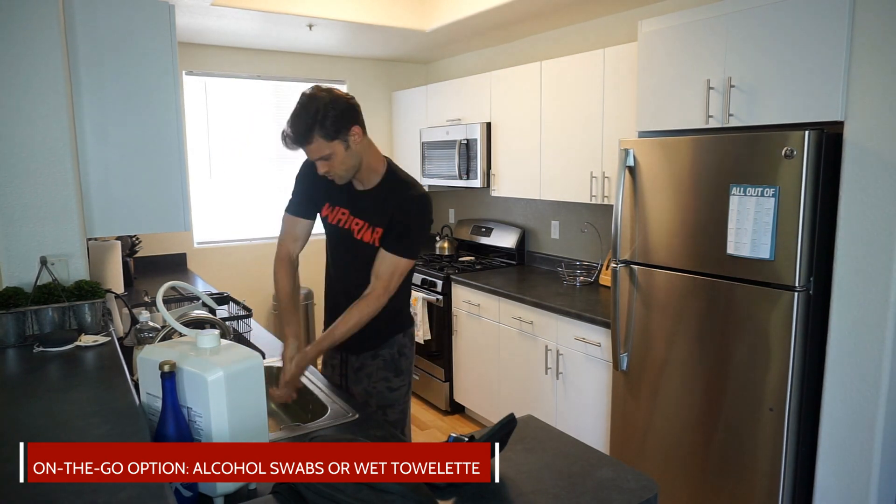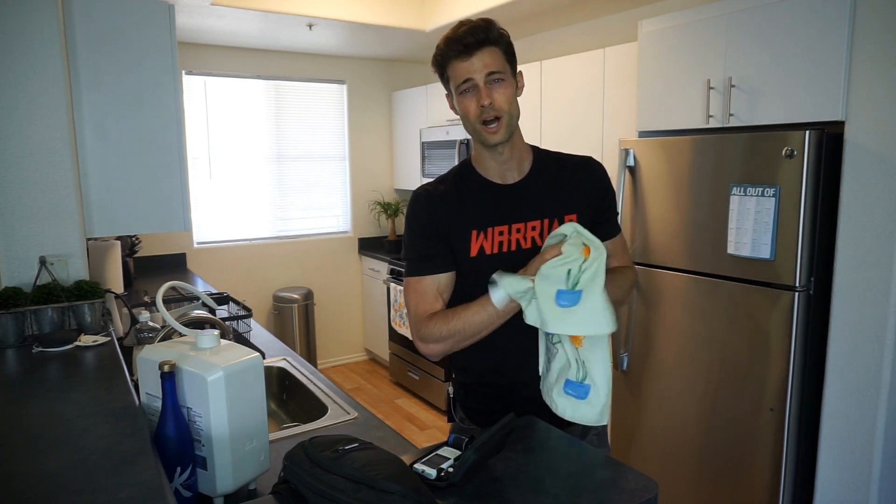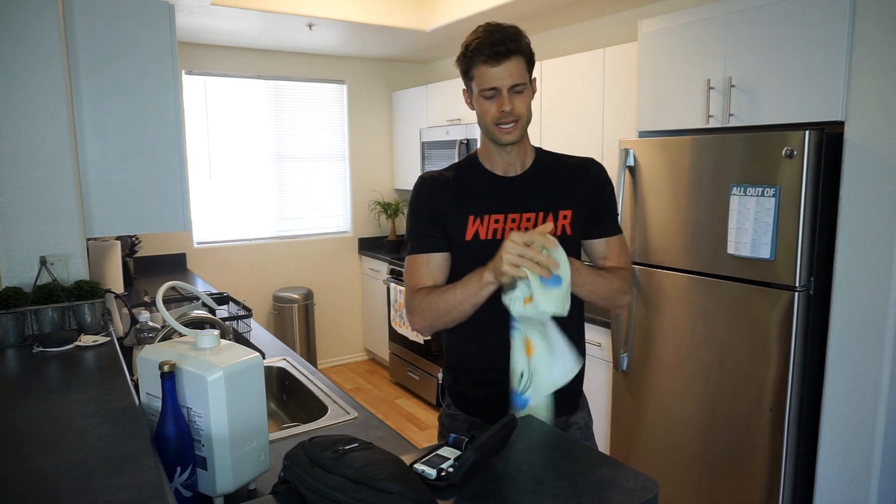First things first — we're going to wash our hands. Make sure your fingers are clean. Reason being, if you have sugar or anything else that can alter the blood sugar measurement, you might get a false high. Your blood sugar might be at 93, but the meter shows 250. If it's 250 and you take medication to bring that down but you're actually at 93, you might have a hypoglycemia event or a low blood sugar. So we wash our fingers to make sure they're nice and clean, and we make sure they're nice and dry because we don't want water on our fingertips either — water can dilute the blood and throw off readings.